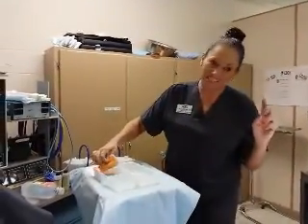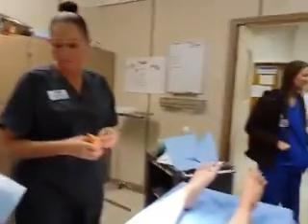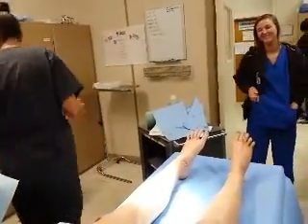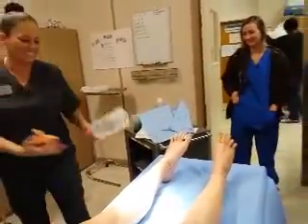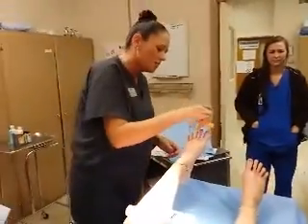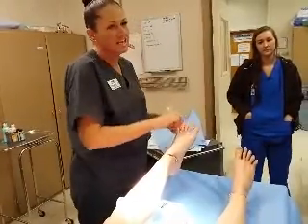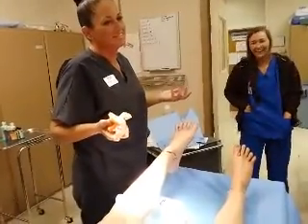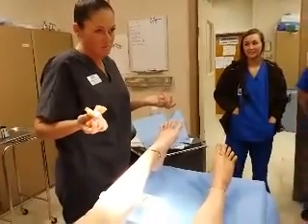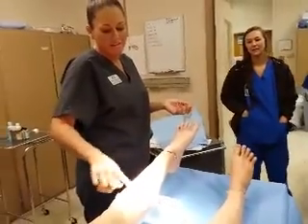On a dummy, they're not so flexible. So listen up before you start whining about it. You're going to be going like this. You can't get in between the toes. We will tell you exactly where the incision site is, or you won't know where to start your prep from. I did have a big red gash here, but it keeps wearing off.